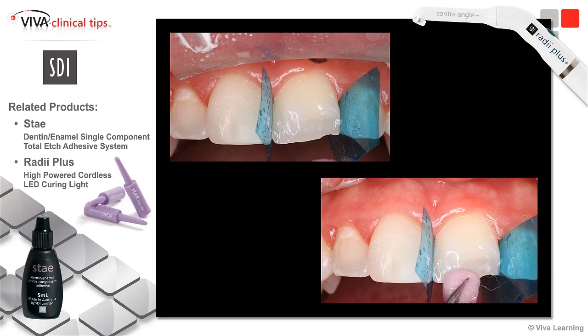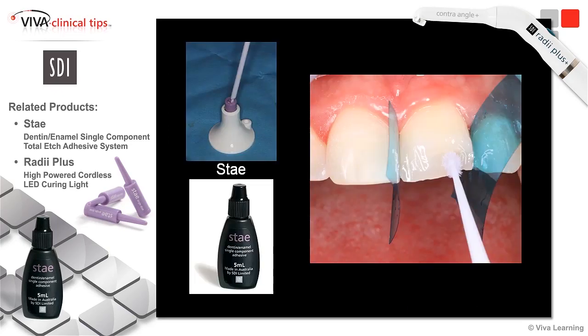We're going to go ahead and place our desensitizer here, for the proper amount of time, suction that, and here I'm using that bonding agent Stay again as well.